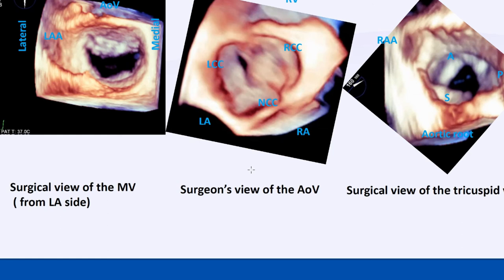In surgical view of the tricuspid valve, the septal leaflet is beside the surgeon. The landmark for the anterior leaflet is the RA appendage; for the posterior leaflet it is the SVC; and for the septal leaflet it is the coronary sinus. Always when showing something in 3D, you have to have a landmark — surgical view and some anatomy — otherwise you cannot convince the surgeon or sell your picture.